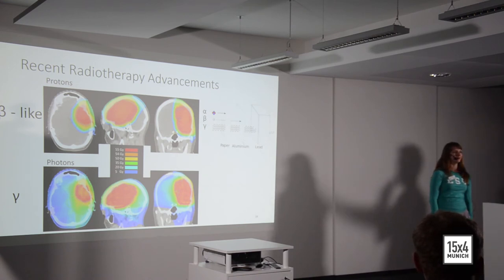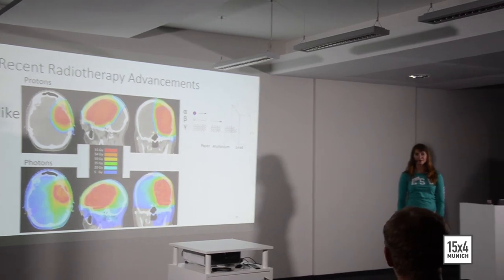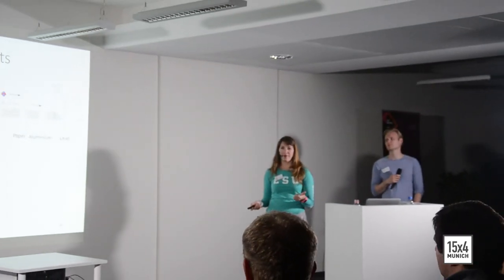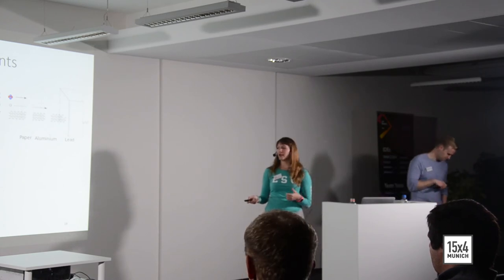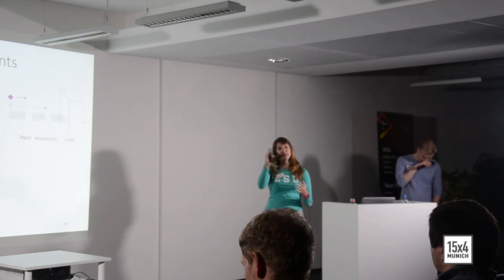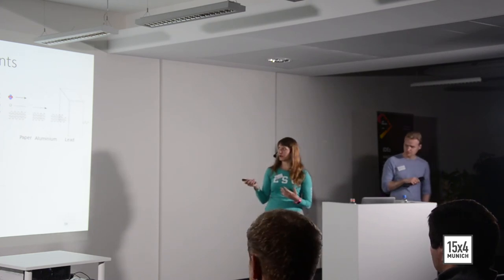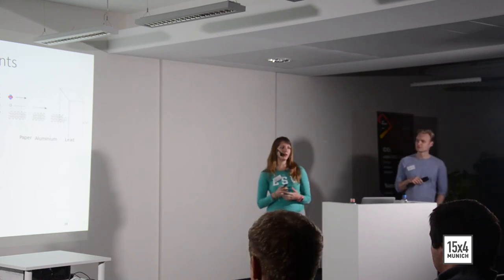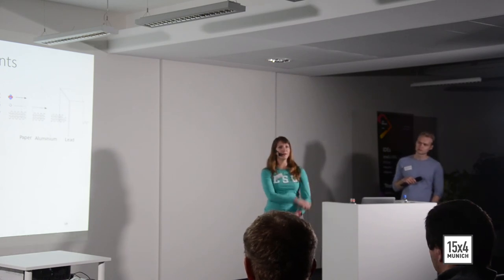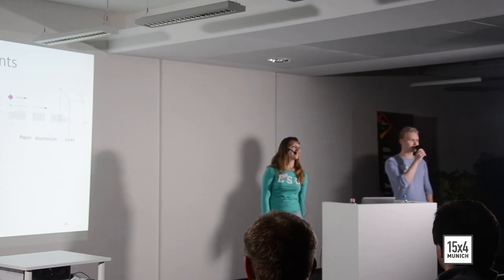Some other questions? Please. I know from engineering, from 3D printing, that they use crossing rays to generate hotspots in any position. Would it be an application for example, beta rays? That is a great question. So that is exactly what we do, and that's why this treatment here, if we were to just use a single photon beam, then it really wouldn't be very effective at all. There's very little differentiation in dose from the entrance to the exit. But this is for a number of different beams that all cross at where the tumor is, and therefore you get a lot of dose right in the tumor and relatively less dose out around it. And we do the same thing with protons. For something that's more centrally located deep in the patient, like a prostate, for example, we would typically treat that with two proton beams that come from either side and meet up in the middle to cause the most damage. Good question. We have time for one more question.